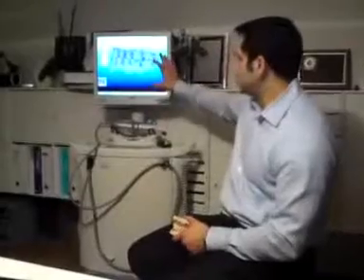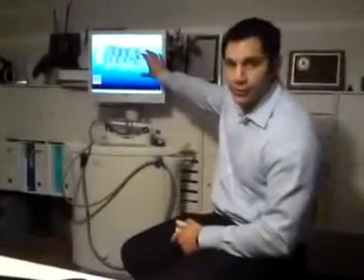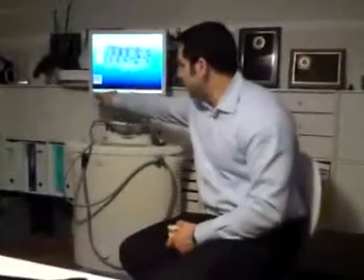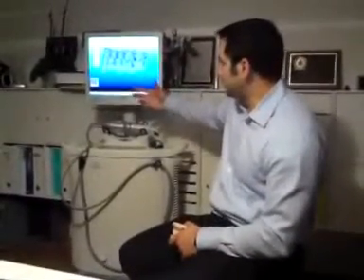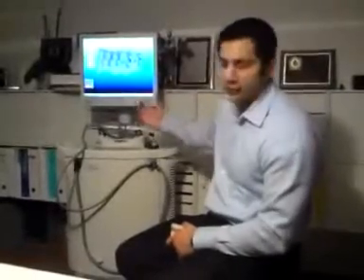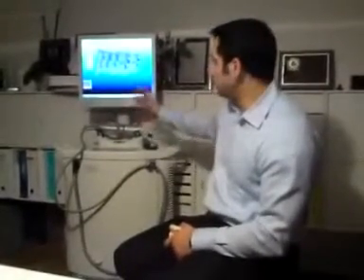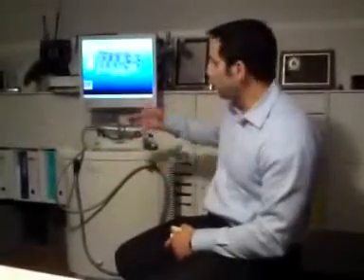So it's really nice to be able to see everything in a relatively short period of time. And keep in mind, this is a low-resolution version of the information. You notice down here it's still calculating data, because the high-resolution data that we capture, this is only about 20% of the information, but we only need 20% just to show it, because the file is actually so huge because of the amount of data that we have. It would slow the computer down, and the doctor would be waiting. So it'll now work in the background. He can see everything he needs to see, and then he's able to function on forward.